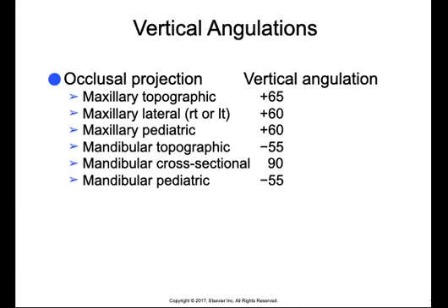The following are some recommended vertical angulations that you can use for these types of images. These are also available on table 21-1 on page 229.